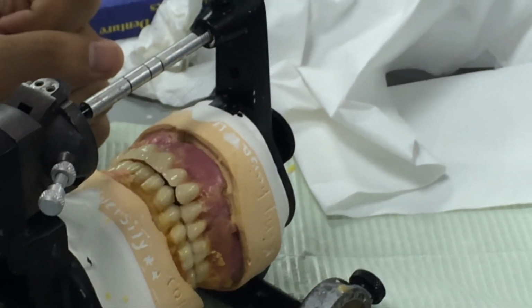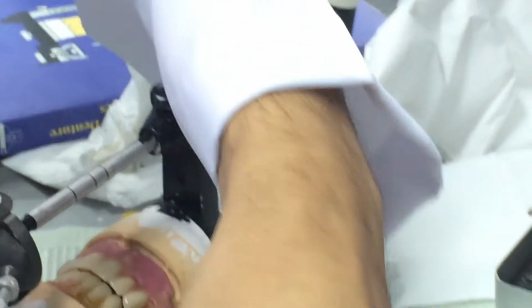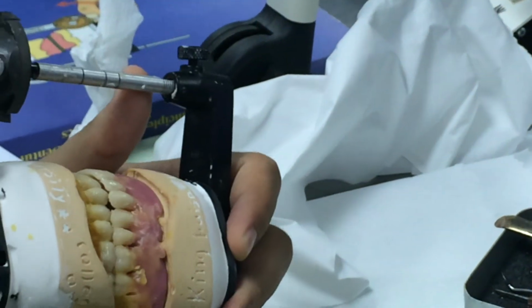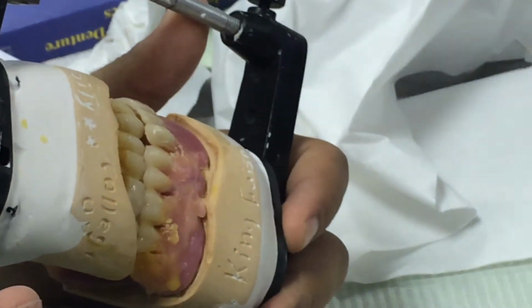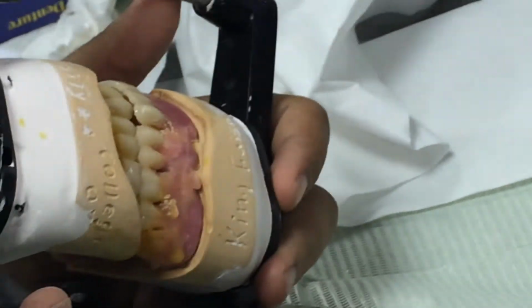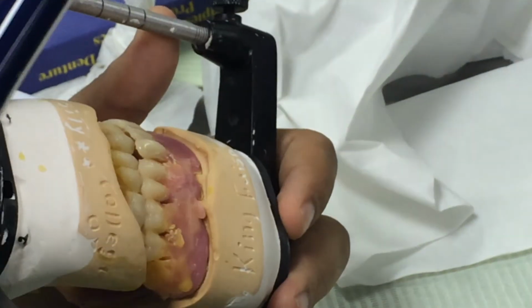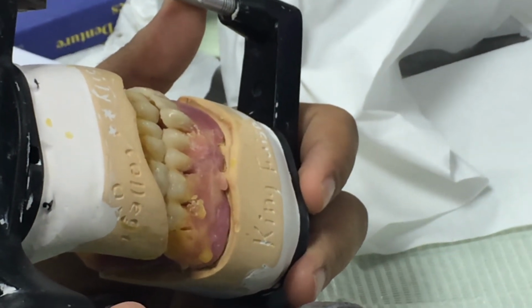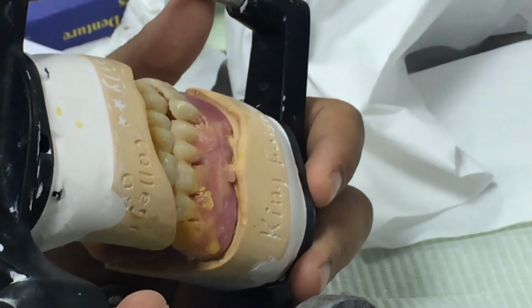Okay guys, then you can see here the overlap and overjet will overlap. Can you see it? How much, approximately?